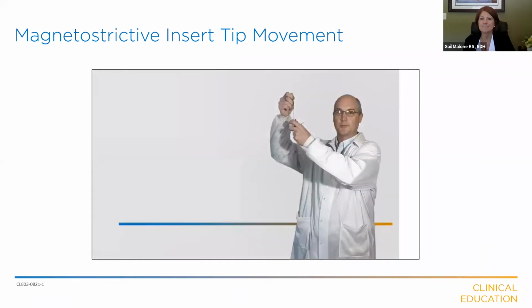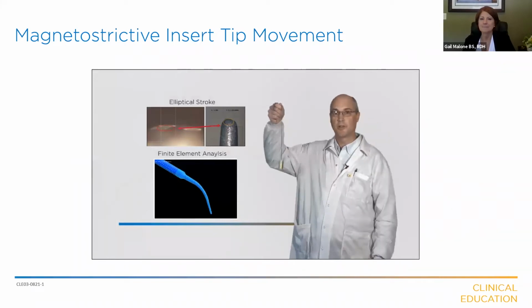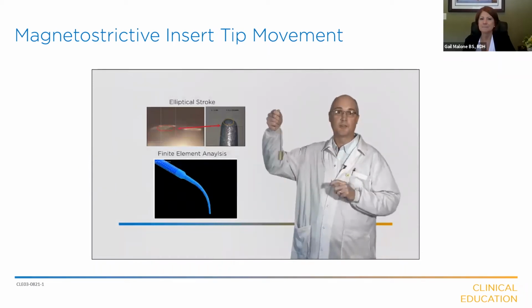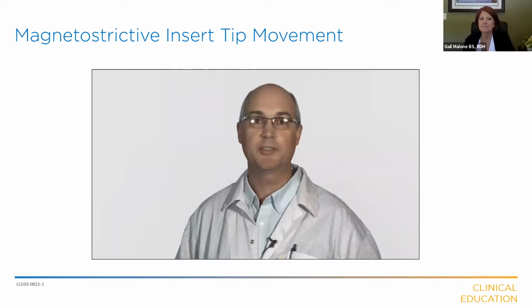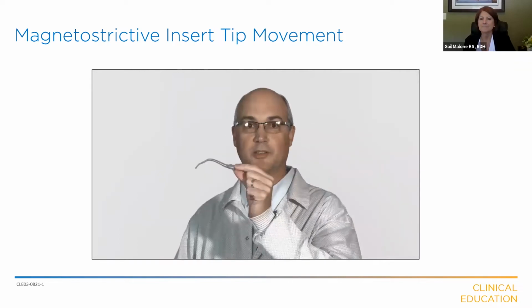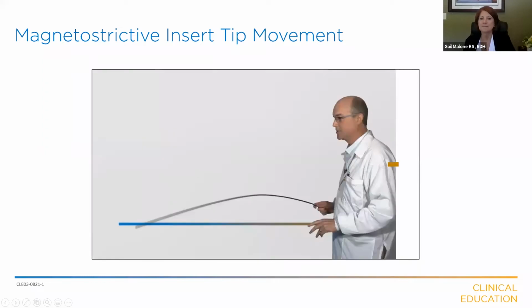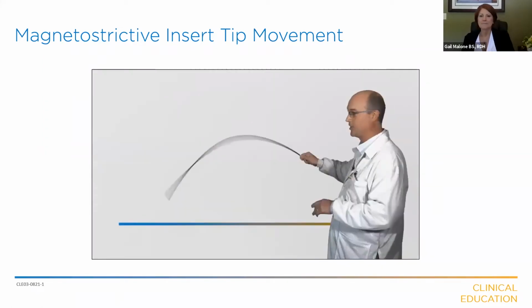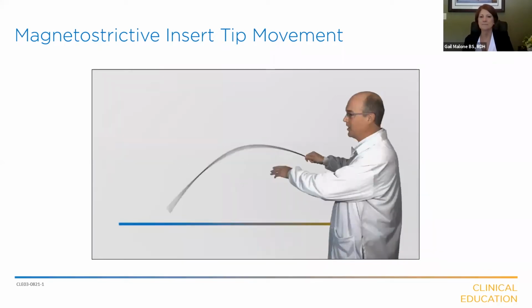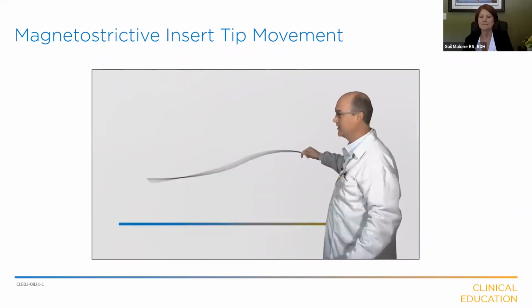Okay, earlier we discussed longitudinal vibration and how the stack generates a longitudinal vibration. That vibration travels through what's called a connecting body into the tip. The longitudinal vibration excites the tip, and the tip begins to move at ultrasonic speeds, creating a whipping action which generates a nodal point at the end of the tip. And I'm going to show you exactly what's happening to the tip as it's excited at ultrasonic speeds. The tip experiences those vibrations and responds with a whipping action that generates this point of no vibration out at the end, and that's referred to as a nodal point.